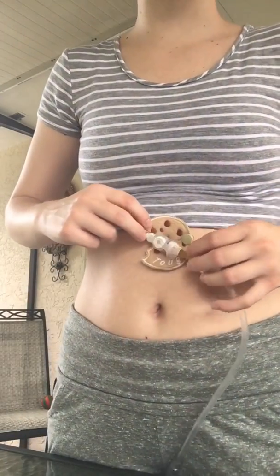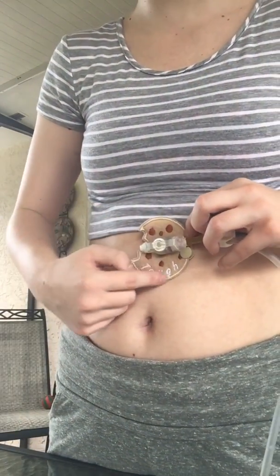Tubey pads are used to soak up anything that comes out of your stoma because stomach acid does tend to come out of your stoma. Some people drench gauze, some people only have a little bit or barely any. Your feed supply company should supply you with a lot of gauze if you prefer to use gauze instead of tubey pads. I have this one from I think it's Tubby Whoopies, and it's a cookie, and it says tough cookie. But I also have these kind that are a little bit more practical and not in a fun shape.